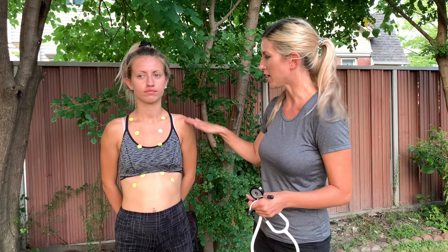Now we're going to do the lung sounds. Basically, you're going to listen on the right side and on the left side. There are three lobes on the right: the right upper lobe, the right middle lobe, and the right lower lobe. There are two lobes on the left: the upper and the lower.